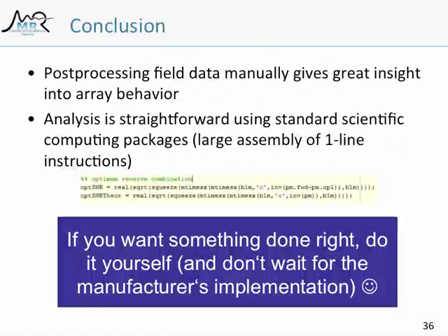And calculating the SNR maps we've seen is a one-liner in MATLAB. So it's just as an example that you can basically, in one line, get those maps, and calculating all those things takes computational time of something like less than a minute.